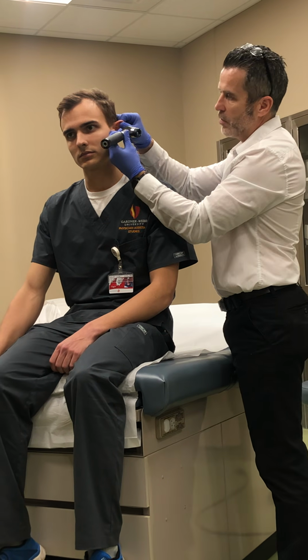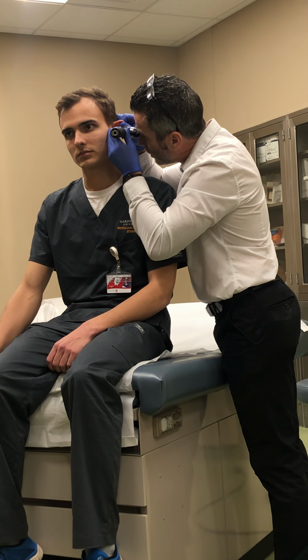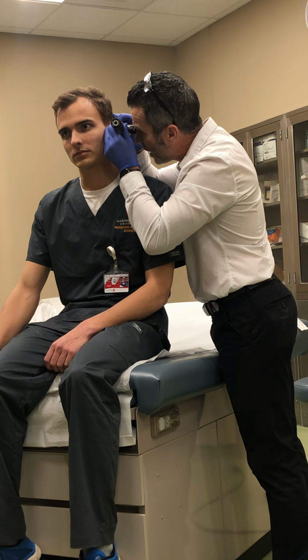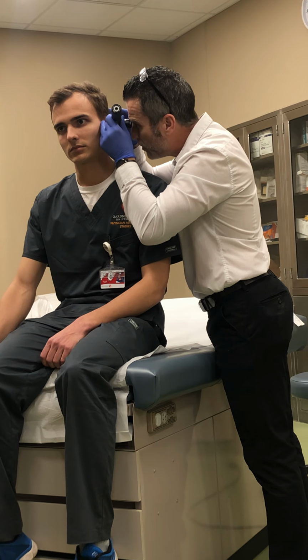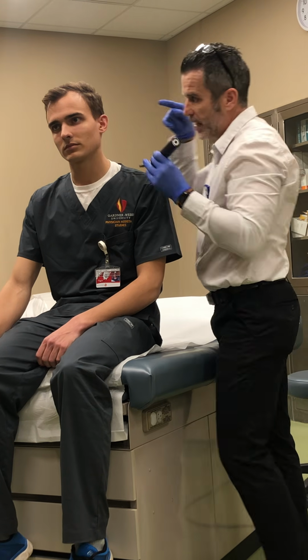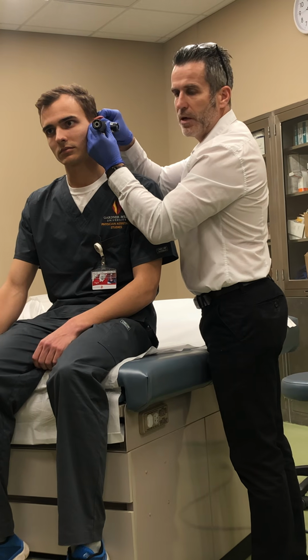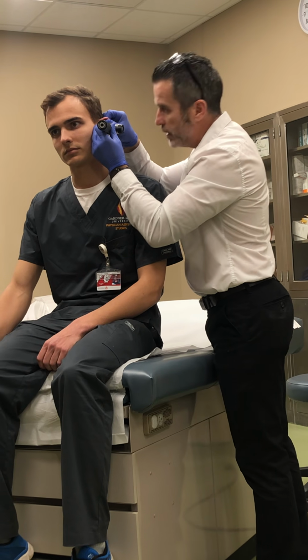So notice as I go in, I'm starting to look at the canal. As I come in, I don't want to go in really yet now. I see a little bit of piece of wax there laying in his external auditory canal. It's kind of golden color. As I turn, I can angle myself because the canal does go inward, so sometimes you have to turn a little bit. But notice Nolan will never be uncomfortable during this whole exam because I'm not going deep.